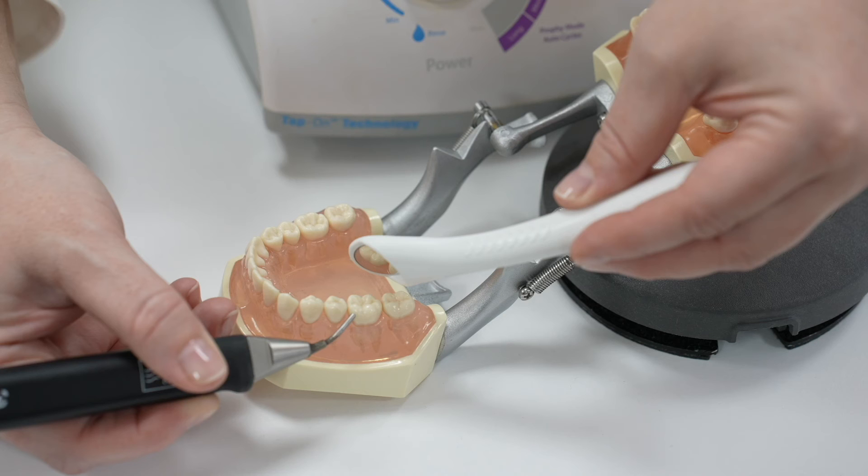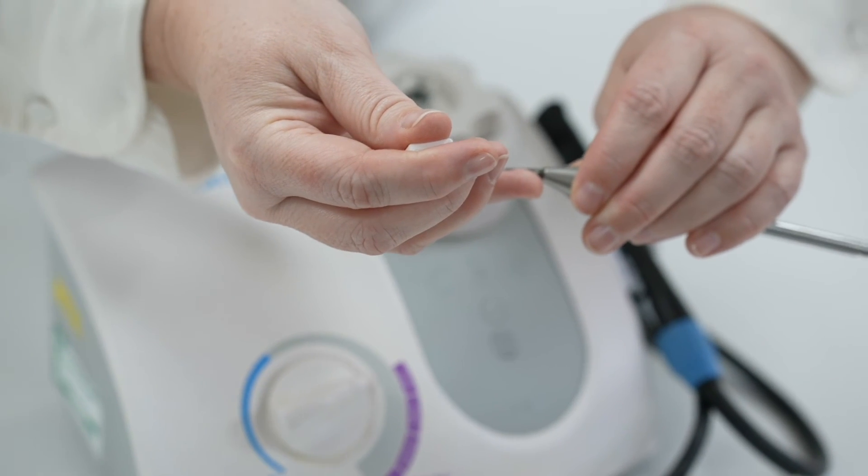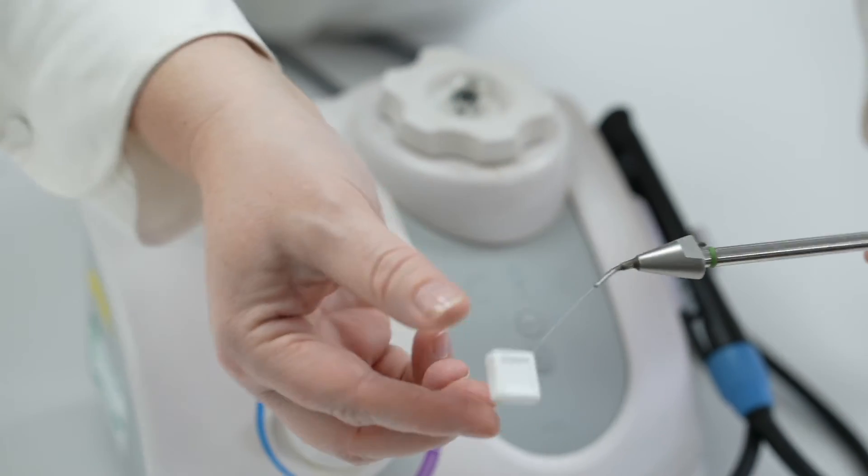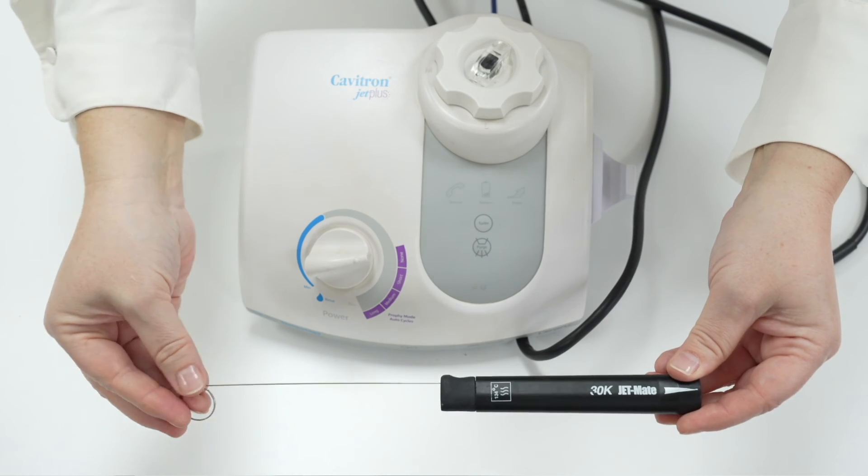So when you have the airline plugged in and the Cavitron is switched on, you should feel air coming through the jetmate and the profi insert. If not, it could be that the air hole has been blocked up in the jetmate.